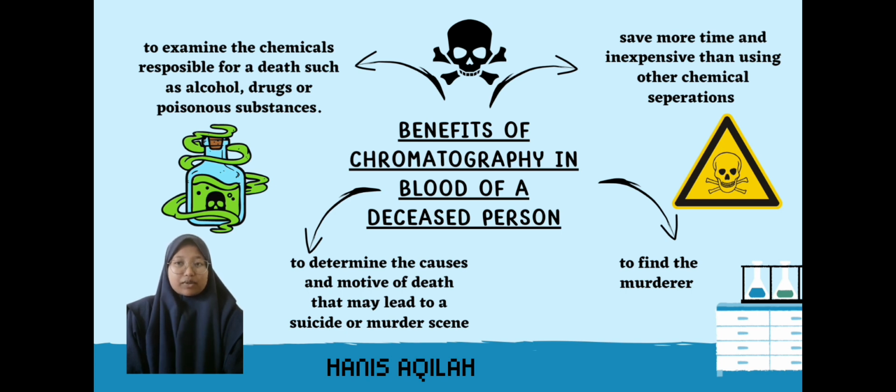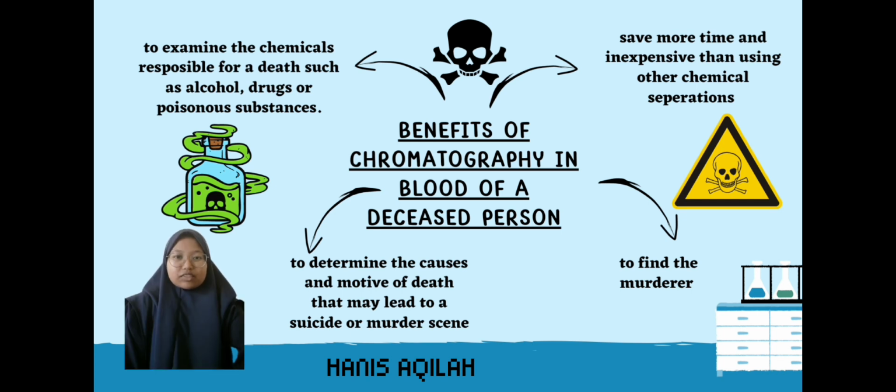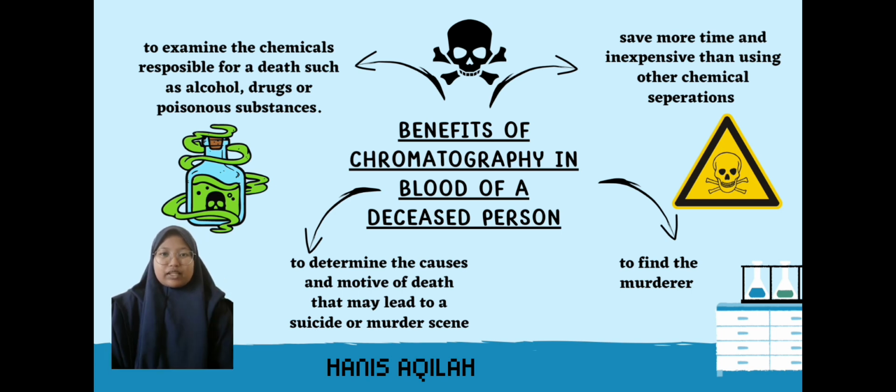My part is the benefits of chromatography in the blood of a deceased person. There are a lot of benefits of chromatography in the blood of a deceased person. The first reason is we are able to examine the chemical that caused a death, such as alcohol, drugs, or other poisonous substances. For example, if the cause is drugs, we are able to trace the type of the drug, either it is legal, illegal, or from the black market.